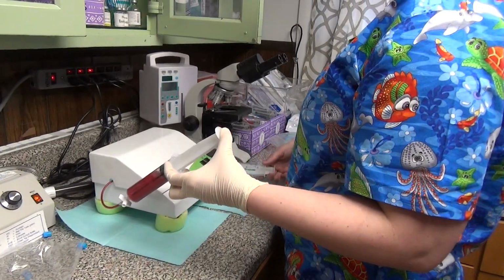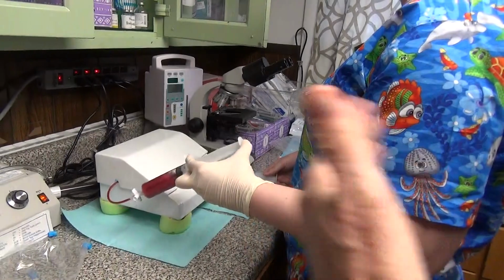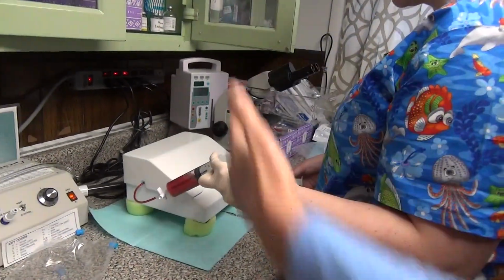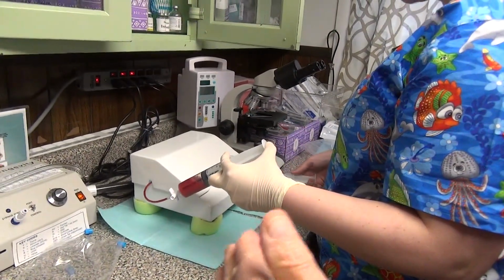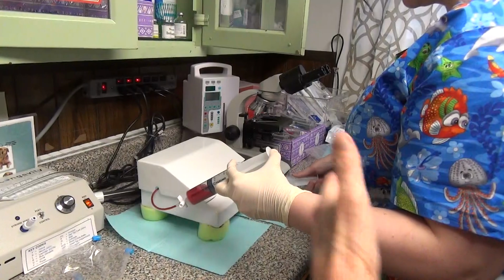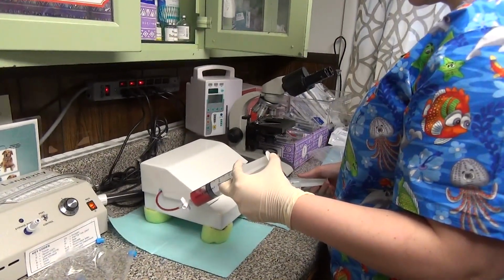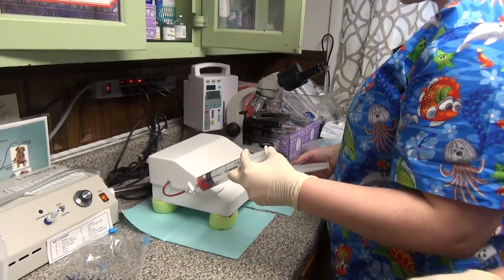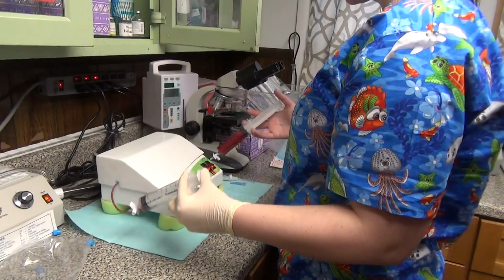And again, you don't want to cram it through really fast, because there is that spinner in there, and the concern is it hitting that spinner really hard. You want it to just sort of wash around it, so that the spinner in there is allowing it to go to the inside of the glass cuvette and get more light exposure instead of just going straight through. But going straight through mixes it too, so you could do it without the spinner in there as well.